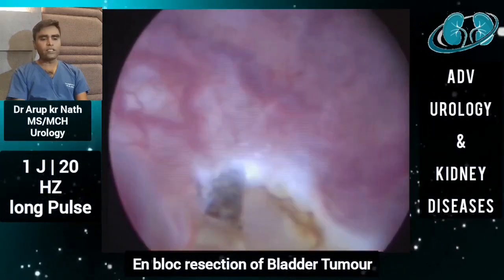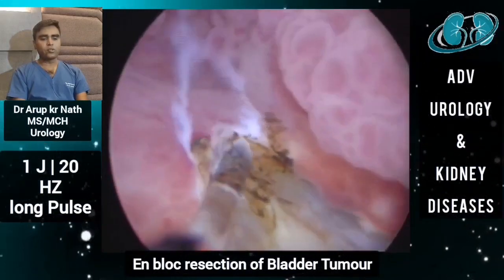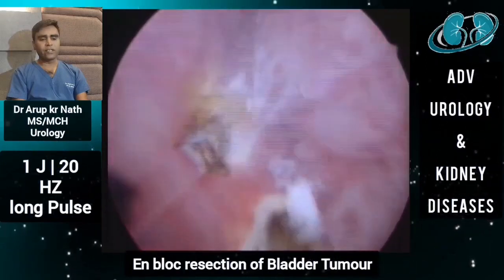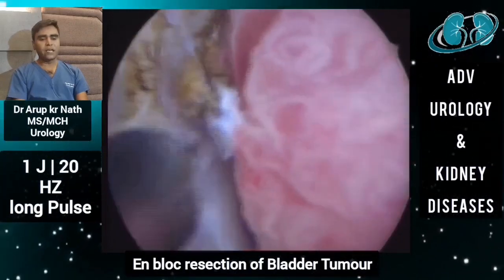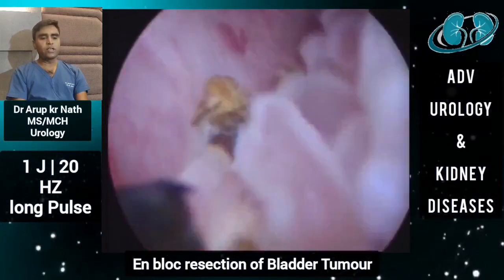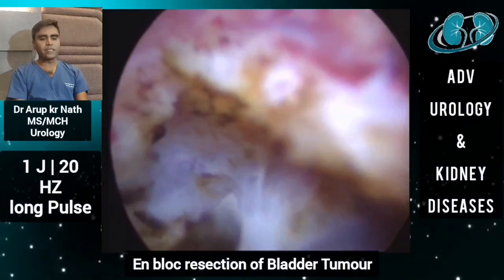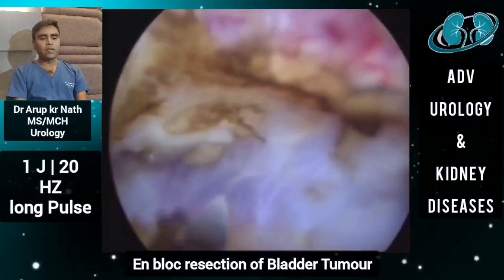En-bloc resection has several advantages: there is no obturator jerk, no bleeding, and the tumor comes out completely from the detrusor muscle. At the same time, we do not compromise oncological safety by cutting through the tumor, which theoretically may lead to tumor implantation and more contact time of tumor tissue with the bladder mucosa. Since we are completely elevating it, oncological safety is preserved as the tumor comes out in one single en-bloc piece.